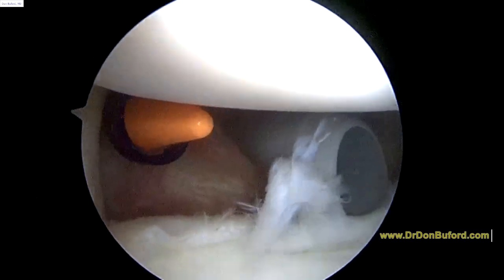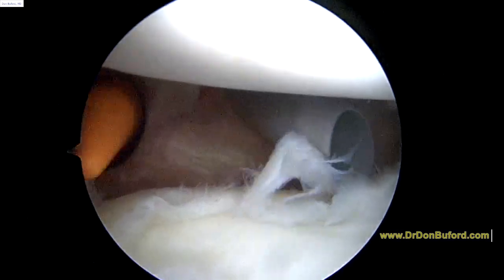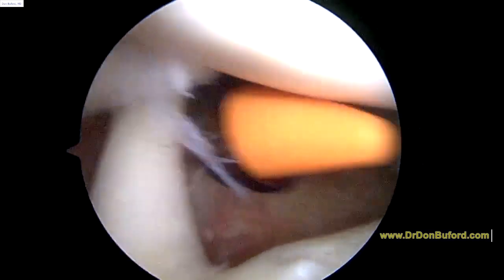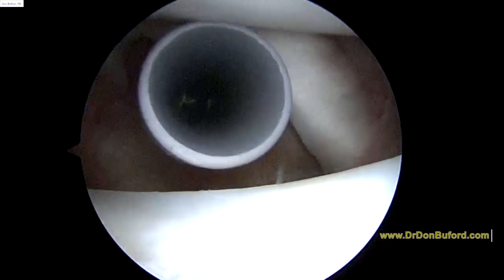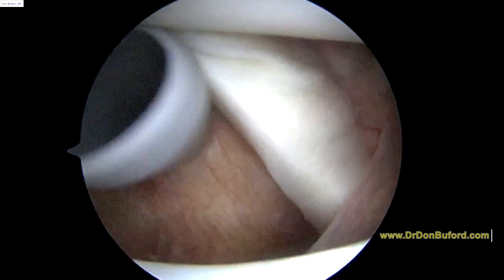All right, so Dr. Buford, we're just getting started on the right shoulder. We're looking inside the joint. We've got two cannulas coming in the front of the shoulder. This is the part of the shoulder we call the rotator interval. We've got a clear one on the left over here behind the biceps, and this gray plastic cannula just above the part of the rotator cuff called the subscapularis tendon, which you see on the right side.